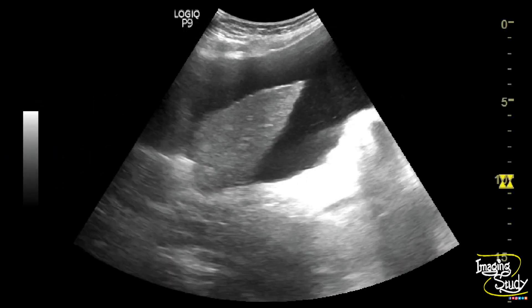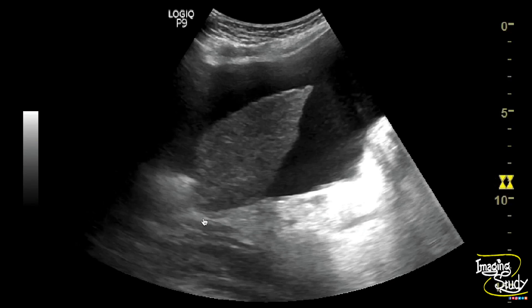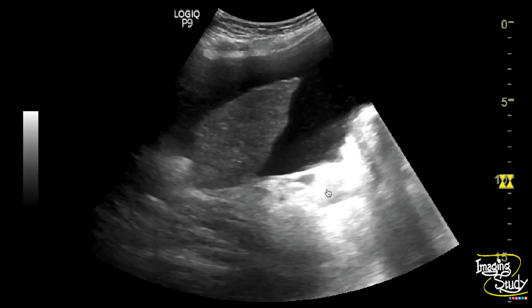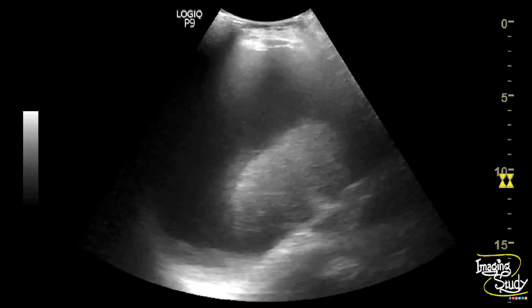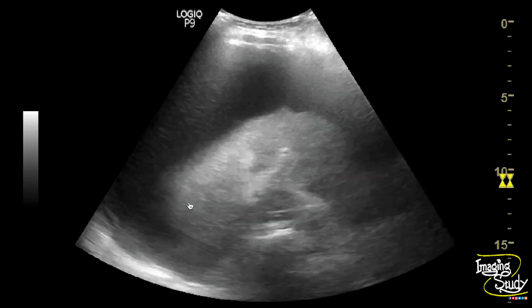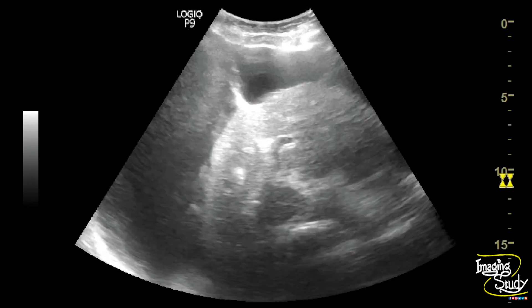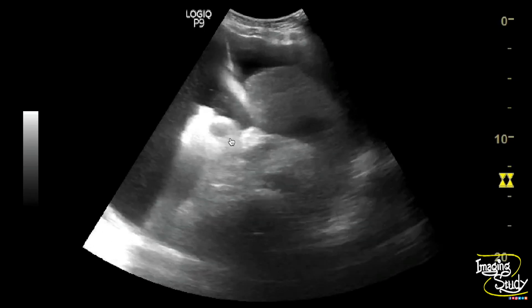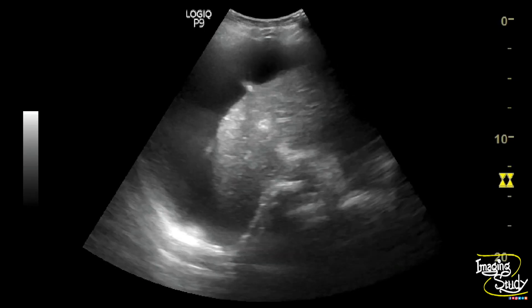Here you can see the left lobe of the liver, which is smaller in size and irregular in shape. There is a huge amount of ascitic fluid collection. You can see both the right and left lobes of the liver — the liver is smaller in size, irregular in shape, with coarse echogenic parenchyma.